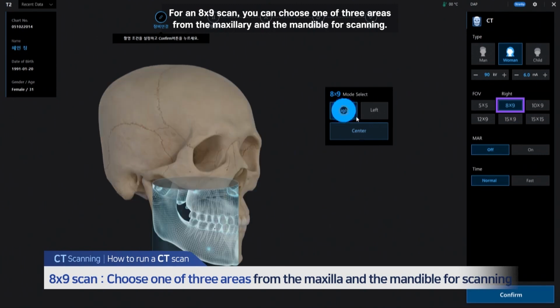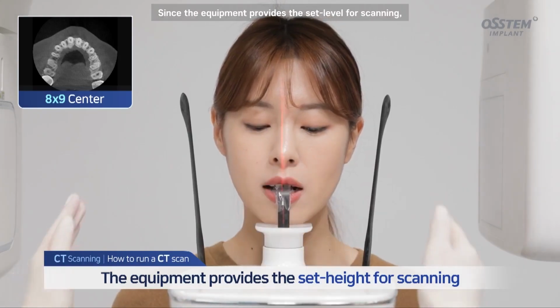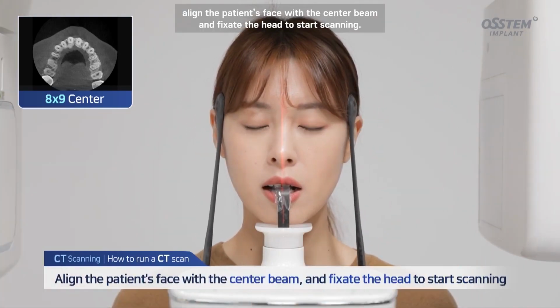For an 8x9 scan, you can choose one of 3 areas from the maxillary and the mandible for scanning, since the equipment provides the set level for scanning. Align the patient's face with the center beam, and fixate the head to start scanning.